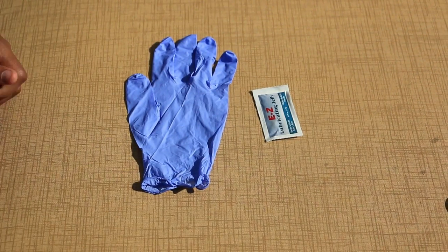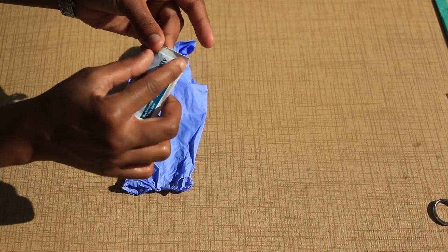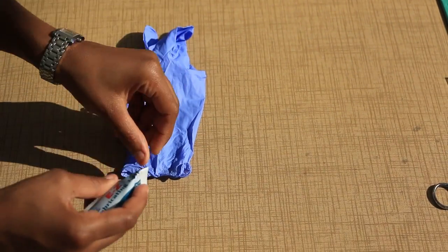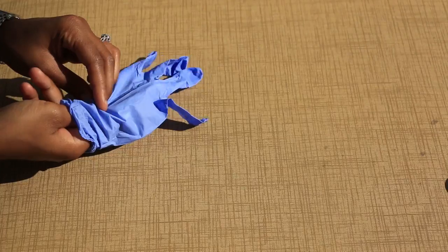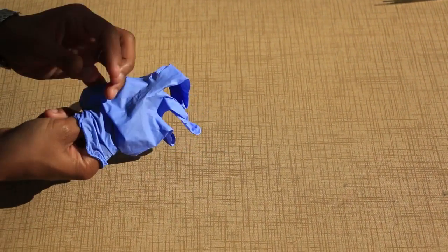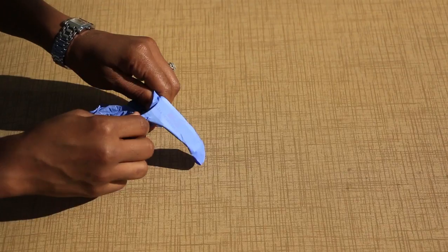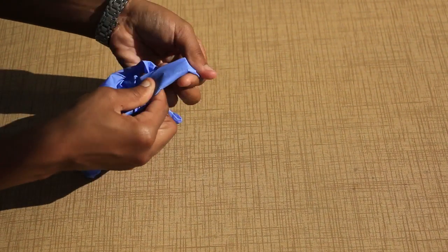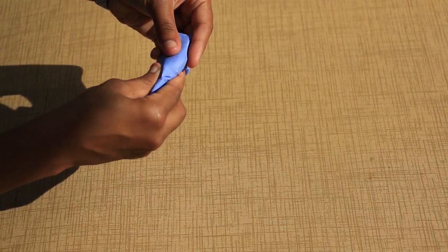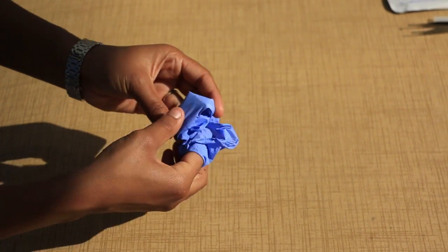To make the simulated Bartholin cyst, you will need a glove and a lubricating jelly packet. Fold the edges of the jelly packet, then place it in the glove. Slide the packet to the tip of one of the fingers. Last, twist the remainder of the finger and glove to hold it securely in place.